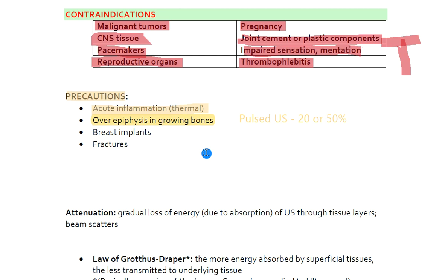And if it's closed, then we know that it's safe to do ultrasound. So that may factor into, let's say you're doing ultrasound around the knee where there could be a growth plate, but if you're doing ultrasound to the hamstring or the quadriceps, you're pretty safe knowing that it's not going to reach into the joint because it's greater than 5 centimeters. So not worried about that.